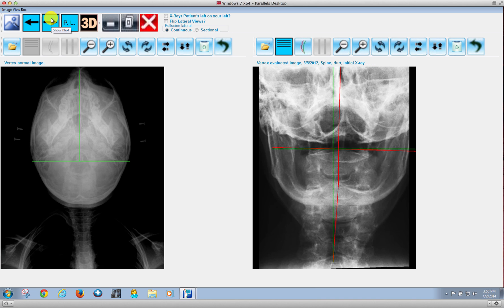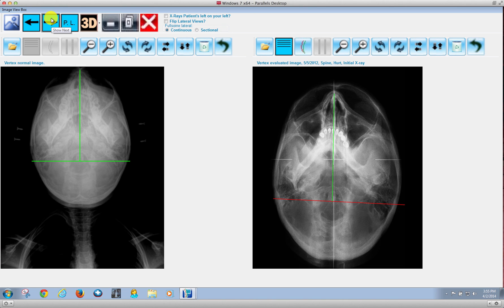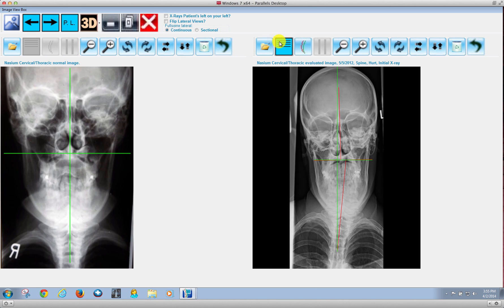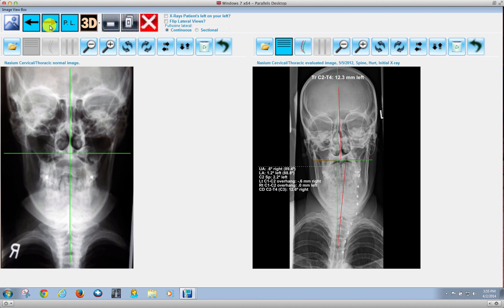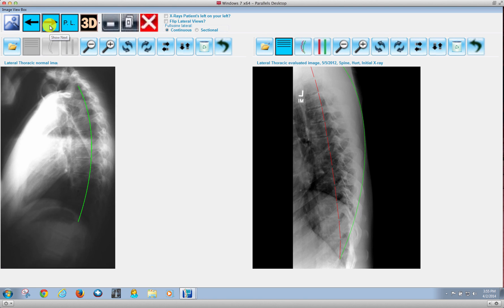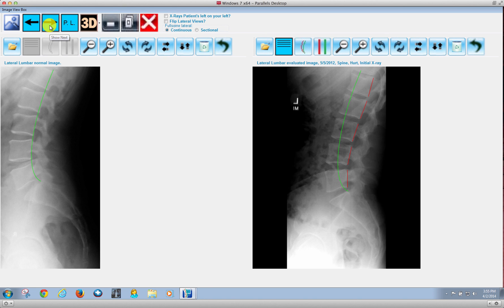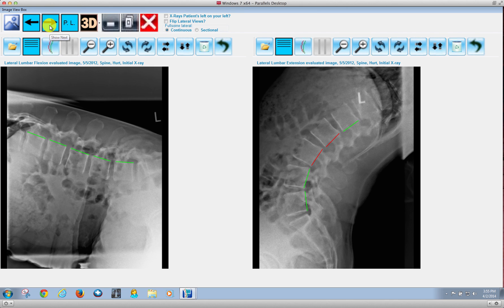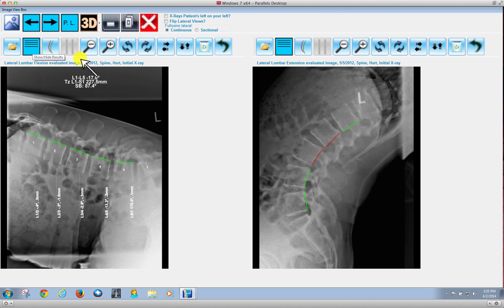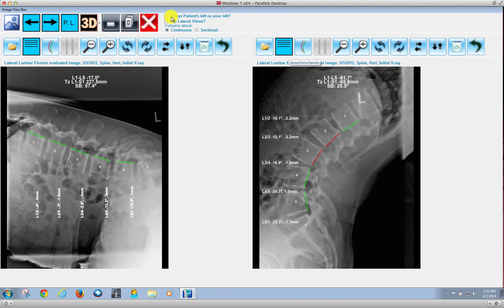The same thing applies to all these different x-rays. Even in the nasium view, we have the overlay and the pertinent information. Let me go to a flexion extension view here. If we go ahead and show this, notice how we're showing the flexion extension angles as well.